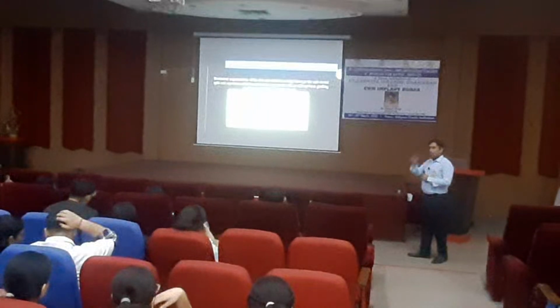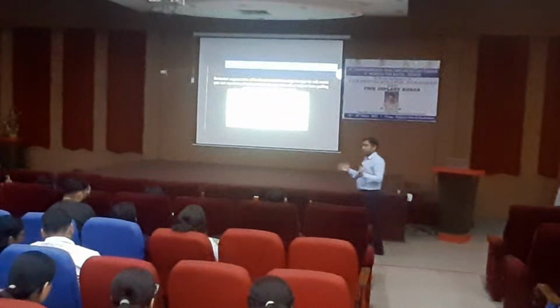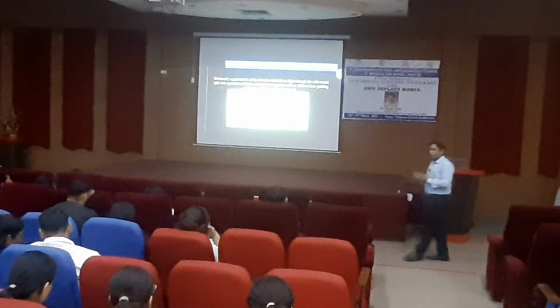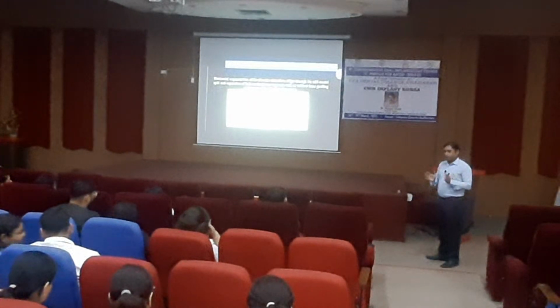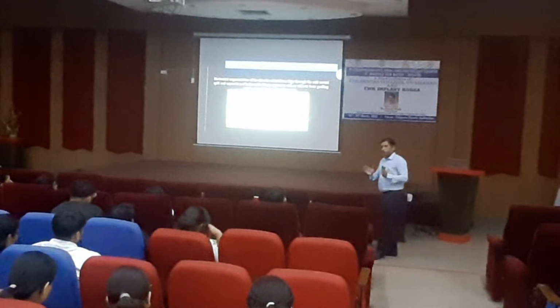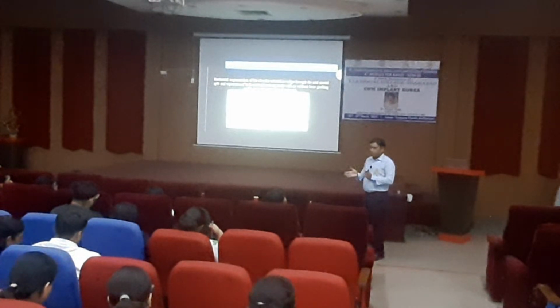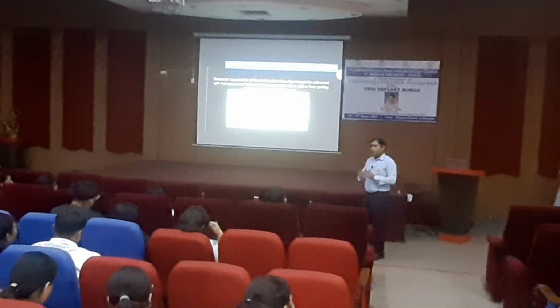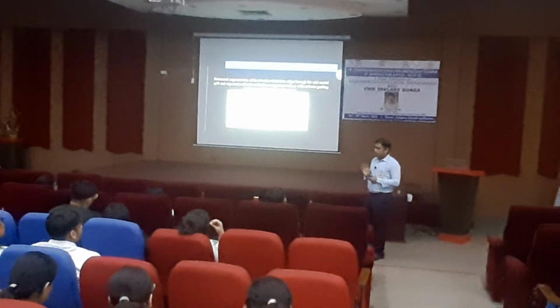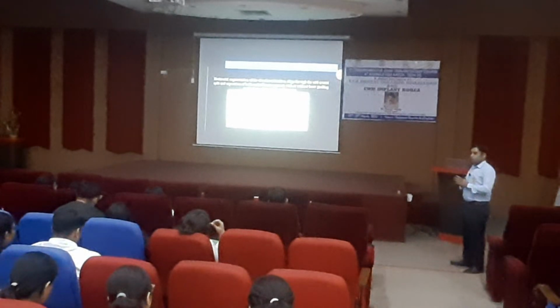It is not that you give a crestal incision, strike the chisel and split both the bones. That means you have fractured the bone. Then most of the time in a ridge split technique, we expand the bone to some limit. For example, if it is 3 mm of the bone, we can expand the bone around 4 or 4.5 mm. That means around 1 to 1.5, not more than that. If you want it to expand till 6 mm, most of the time one of the walls is fractured. Okay, and that is one of the causes of failure of your implant. So expand in a controlled manner.